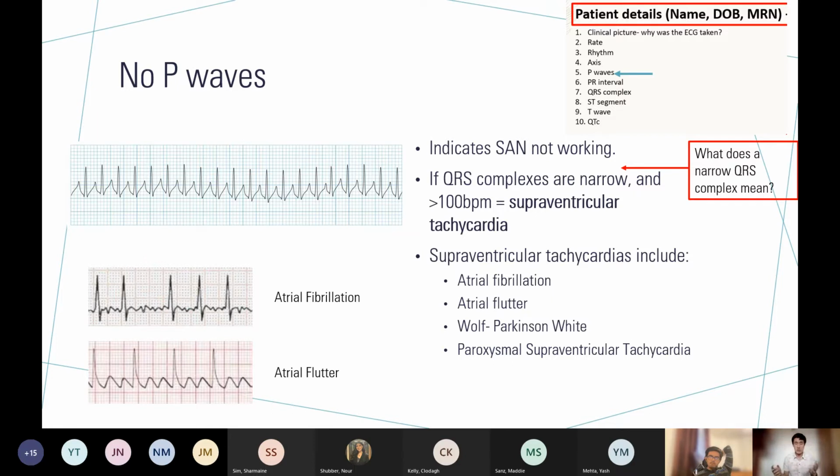Fibrillation suggests that the atria are beating very, very rapidly, but also irregularly. There's no pattern to it. And that's why you get an irregular rhythm, because there's no pattern to it, and it's just the random lucky atrial depolarization that leads to one of those QRS complexes that get conducted. With flutter, they're also beating very fast, but at a regular rhythm. The atria will be beating very fast, usually 300 beats per minute, and the AVN transmits them at a regular pace. So you usually get a regular sort of 150 beats per minute from the QRS complexes.